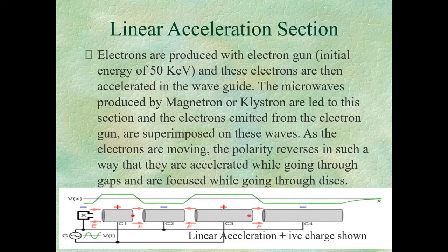I have not seen it happening a lot, but in accelerators, I've seen some centers when I was in Las Vegas that were not doing monthly QAs. And when you ask them, why are you not doing monthly QAs? They would say, have you ever seen output change? And yes, I have seen output change. Output does change. So it's a good practice to do these tests, because if we don't do our tests, we don't know the status of our machine. These may not change for years, and then suddenly there will be a change, and you should know when that change happened.